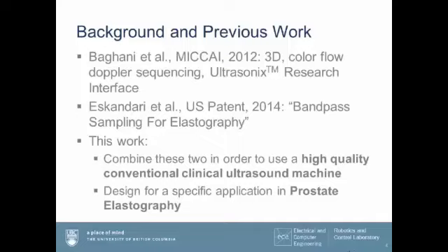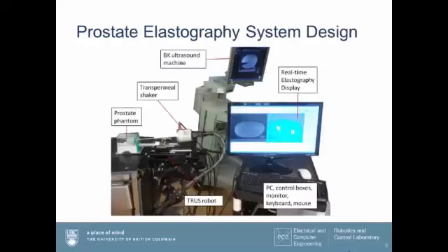So in this work, we look to combine the two of them to provide 3D elasticity and extend that. Ali's work was with the ultrasonics research interface, but in this case, we want to extend it to use a more high quality conventional clinical ultrasound machine.